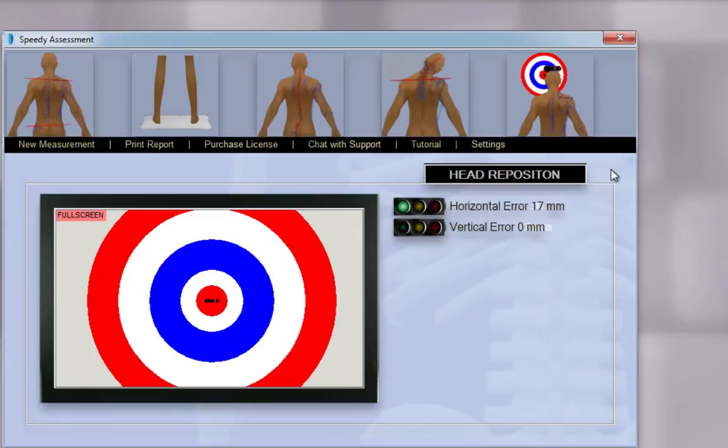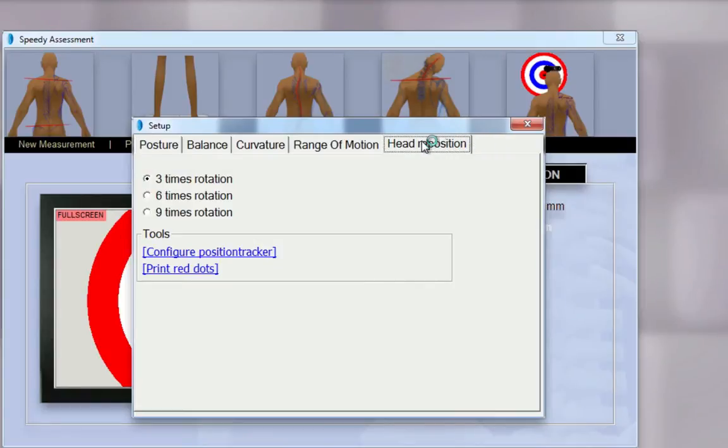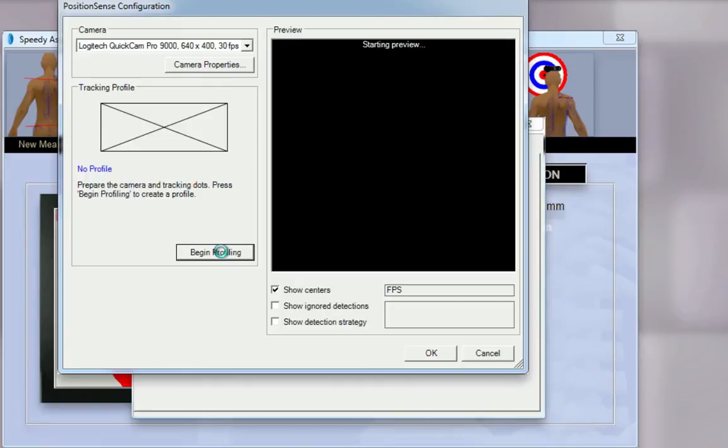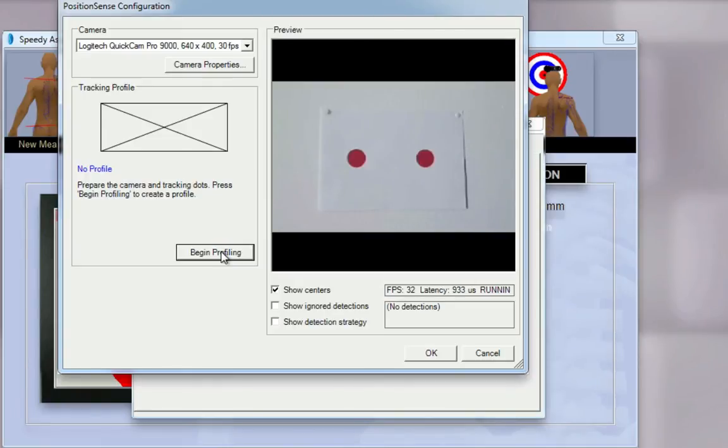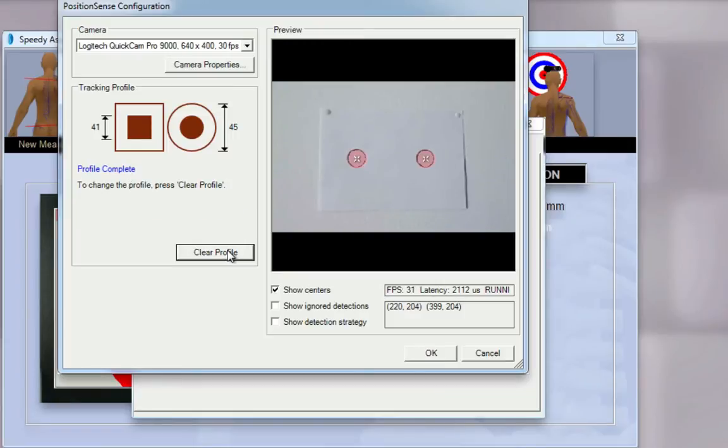To get started, click on Settings, then click on Head reposition, then click on Configure position tracker. Choose Begin profiling and click on one of the two red dots. When your computer has found the two red dots, click on Finish profiling.